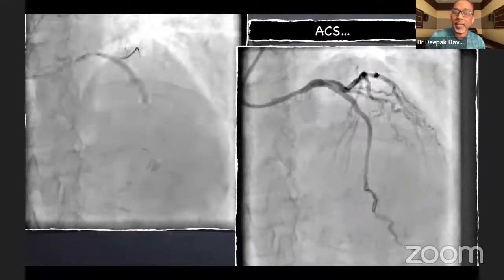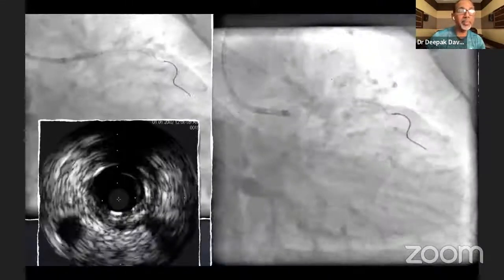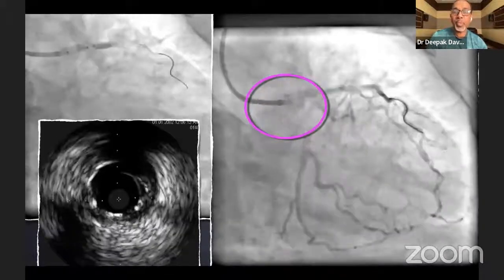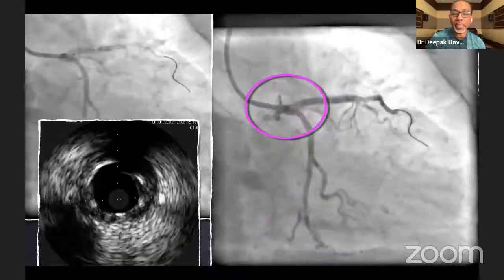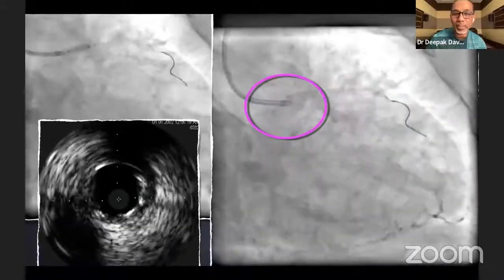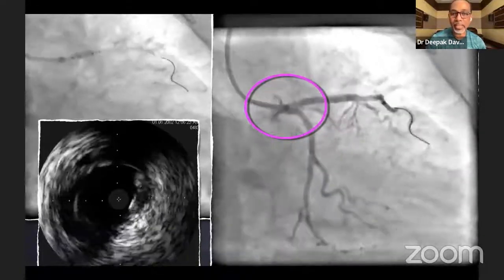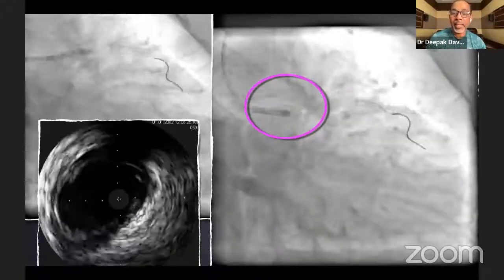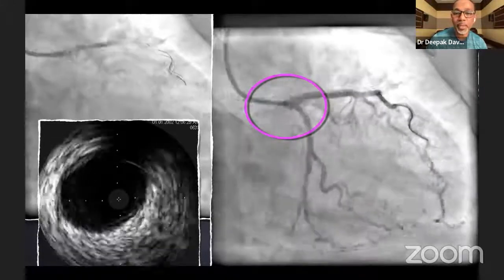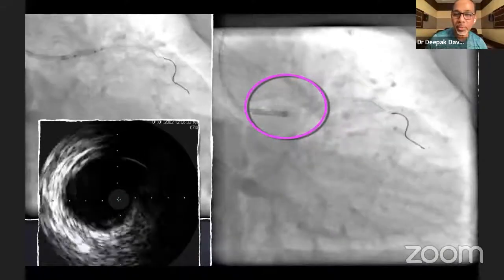But however, it was a long stent. We had to go ahead and post dilate it. So that's the post dilatation being done in the first image. And second image was something very interesting. You could see that following the post dilatation, there is a haziness at the left main bifurcation. You cannot just stop the procedure there. The flow in all the vessels is good, but still looking at that particular haziness there at the left main bifurcation, you cannot stop the procedure there. And so we had to start off with an imaging. So that is the point that I wanted to highlight.